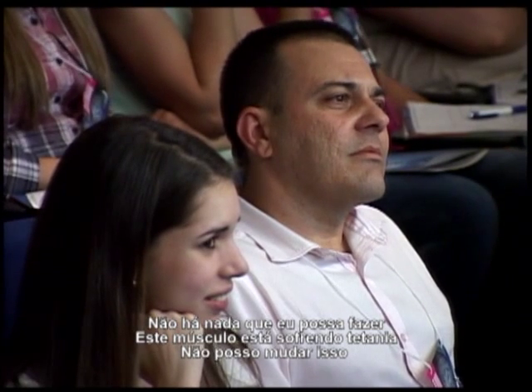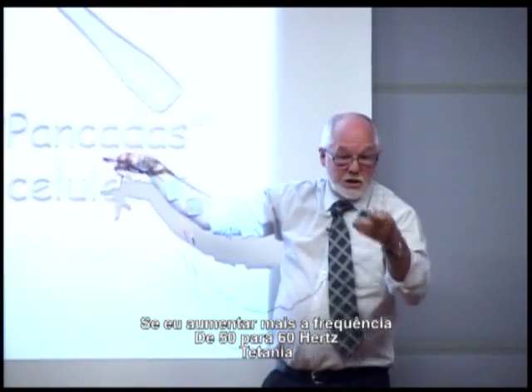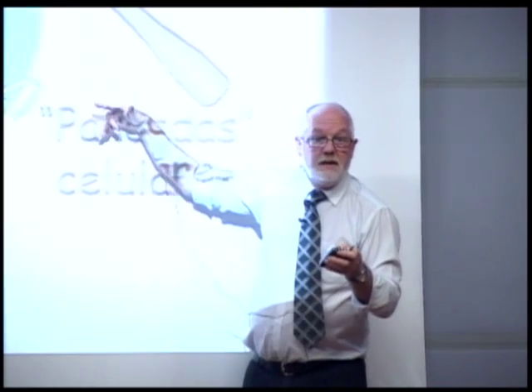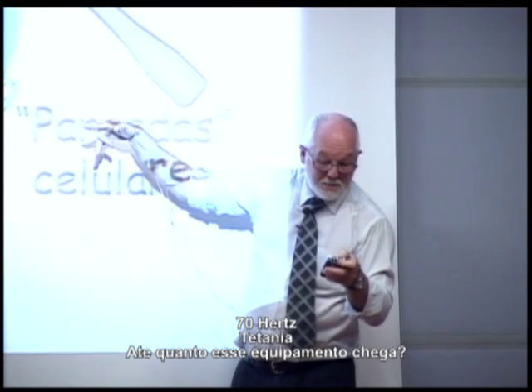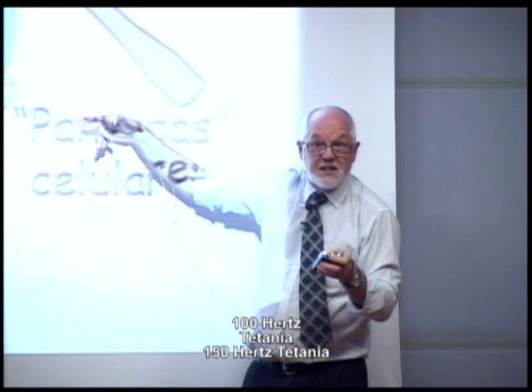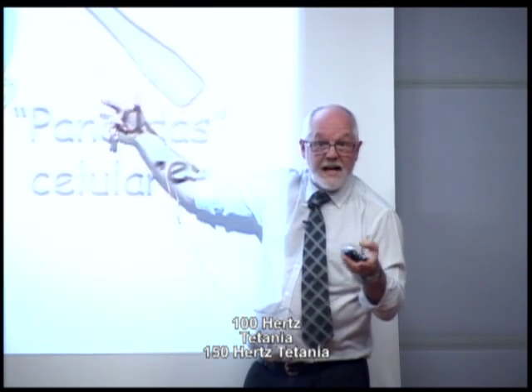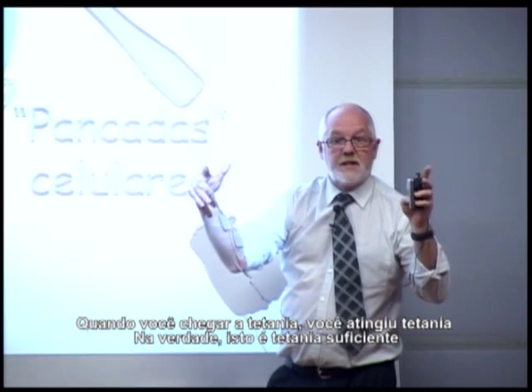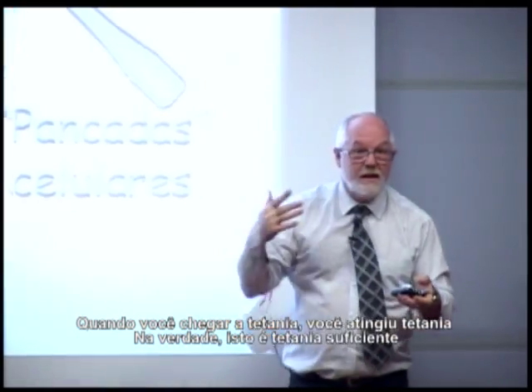I can't change it. If I turn the frequency up more, so from 50 hertz I go to 60 hertz, tetany. 70 hertz, tetany. How high does this machine go? 100 hertz. Tetany. 150 hertz. Tetany. Once you've reached tetany, you have reached tetany. All right? And actually, that's enough tetany.